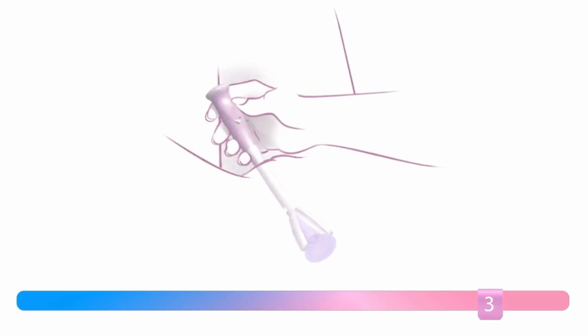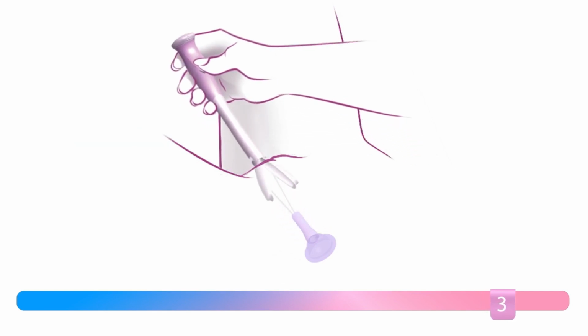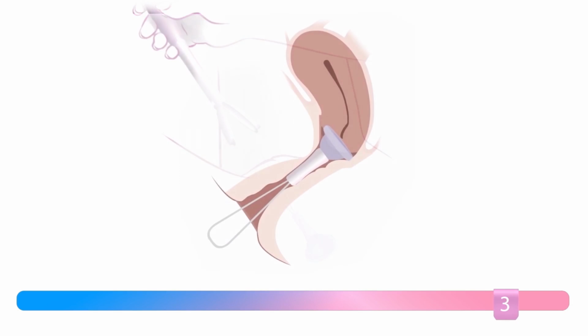Step 3. Release the cervical cap by depressing the cap release button with 3 raised dots. Remove the applicator. The removal string is now exposed.